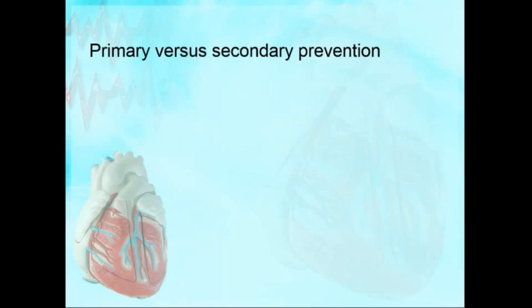Nothing ever happened to this patient, but you're trying to prevent VT death. That revolutionized cardiology and the field of electrophysiology. You went from putting one or two ICDs in a year in a fancy center to people putting 150, 200 ICDs in a cardiology practice, not even EP, just one person. It also helped the development of the electrophysiology fellowship, to me. The more and more ICDs and ablations packed on, it became a separate fellowship by itself, because now electrophysiologists could sustain their living because of all of this together.